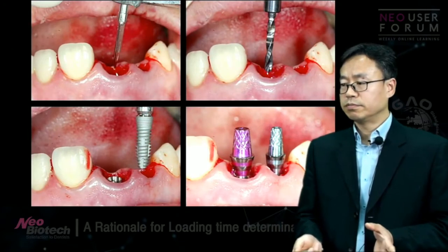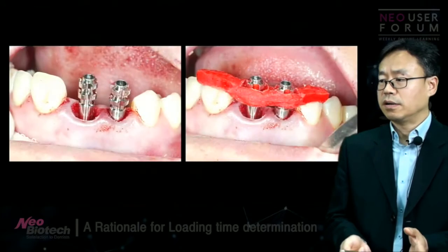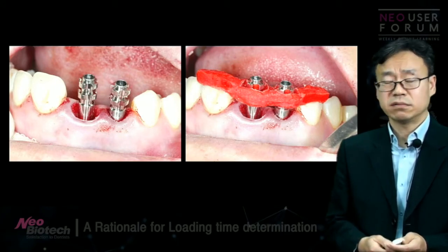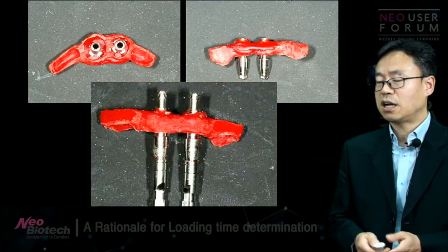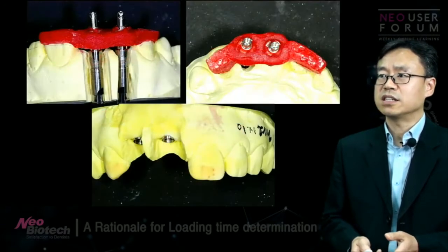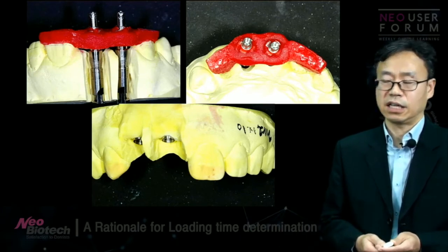And this shows you placing two implants slightly palatally, which you can't really see from this view. And instead of taking a rubber impression after surgery, I used one of the surgical indexing to make a provisional restoration. I'll skip most of these prosthetic processes. I just wanted to show you what I did. I changed the diagnostic model to the working cast using the surgical indexing technique.